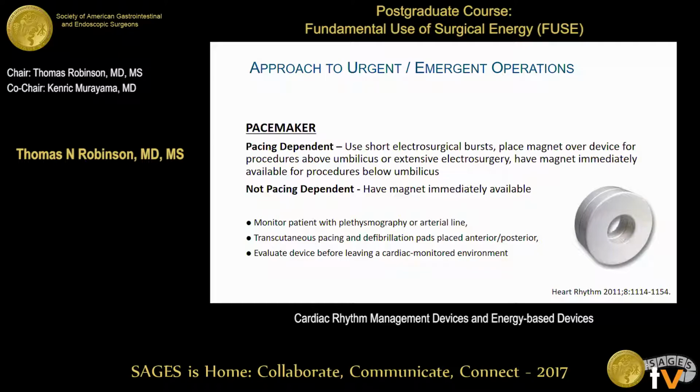If it's above the belly button, then you should be putting a magnet over the pacemaker, always putting on, and this second one I think is key, always putting on your transcutaneous pacing and defibrillator pads, because you don't want to be scrambling doing that if you run into some problem.